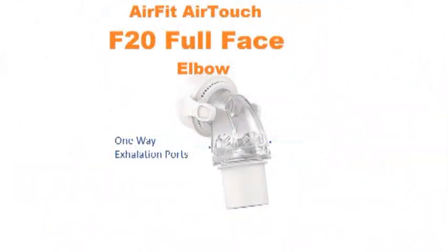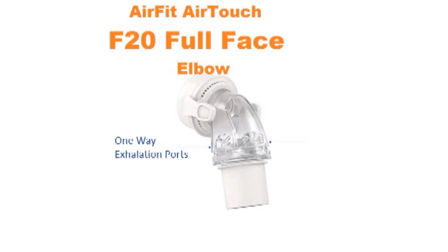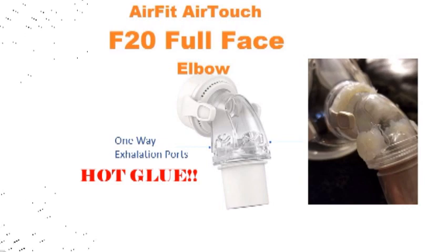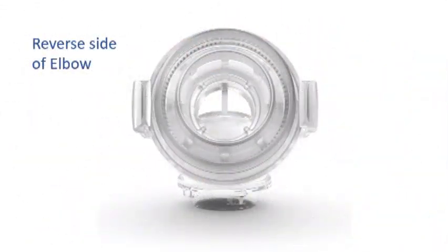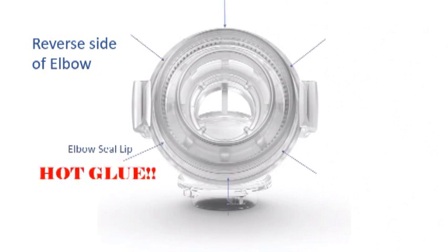The ventilation ports — those are the bigger holes connected to the silicone flaps at the bottom. Take some hot glue and glue up those holes, making sure there's no air getting in and out of that area. On the reverse side of the elbow there's a lip that goes around the outside — go ahead and put a little bit of hot glue around that lip so it makes a good seal with the mask.